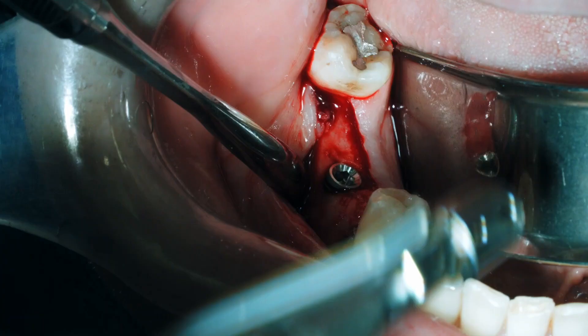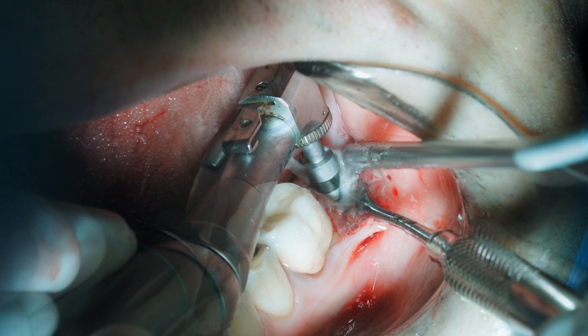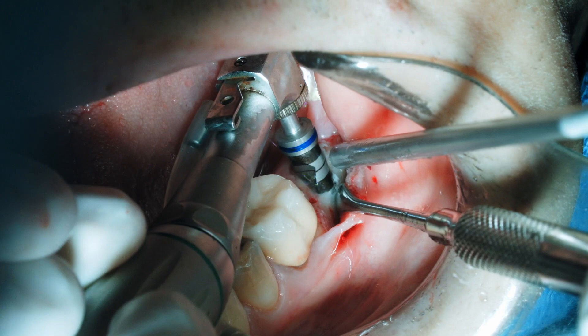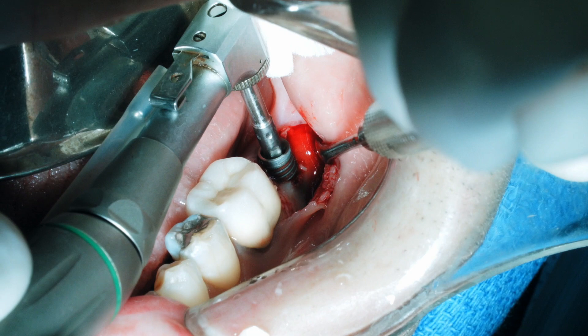That implant is then sunk the rest of the way with the hand ratchet and a cover screw is placed. On the other side we're using the number two multi-drill, and on this side we'll use a modified step-by-step approach going from the number two multi-drill to the number four multi-drill, drilling to 11.5 millimeters — the thin black line between the two thicker ones. The implant is placed again at 45 newton centimeters. Again we can see the blood attracted to the sandblasted acid-etched implant surface, and we're going to get a nice high primary stability.